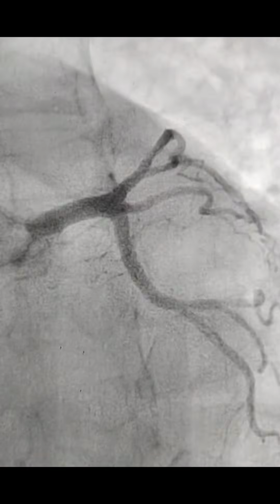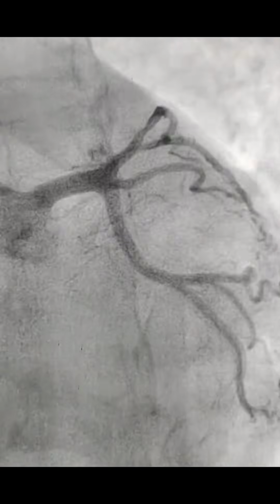He's a 51-year-old male. He's a tobacco chewer only, with no other risk factors. He now presented with an evolved anterior wall ST elevation MI after 3 days.